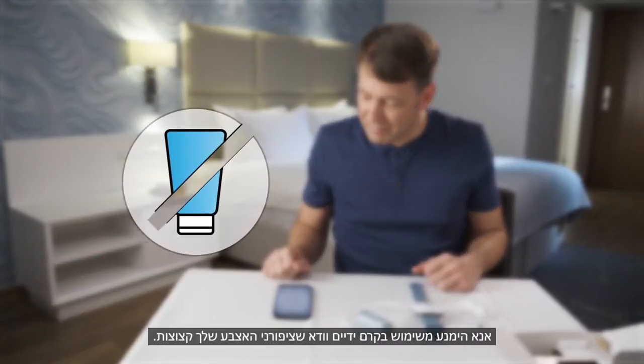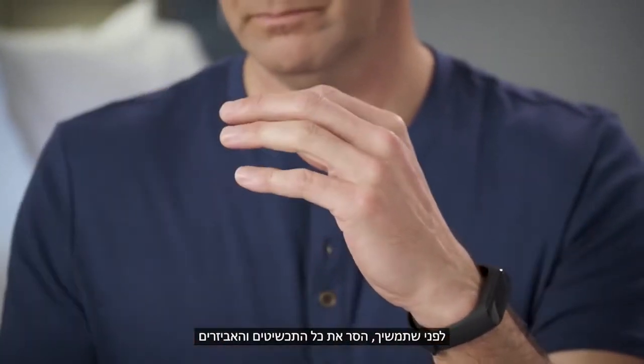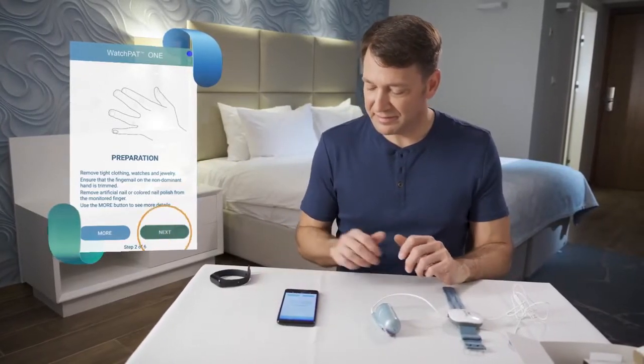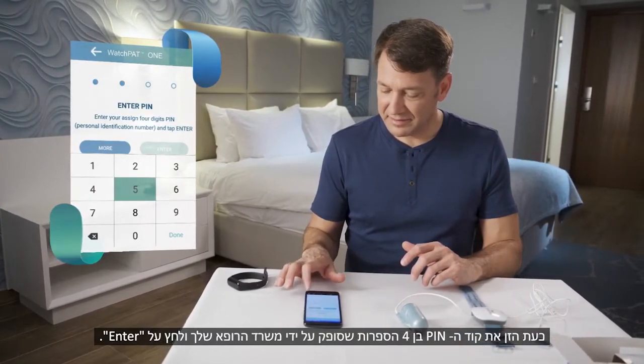Please avoid using hand cream and make sure your fingernails are trimmed. Before continuing, remove all jewelry and accessories, and then press Next. Now enter the four-digit PIN code provided by your physician's office and press Enter.